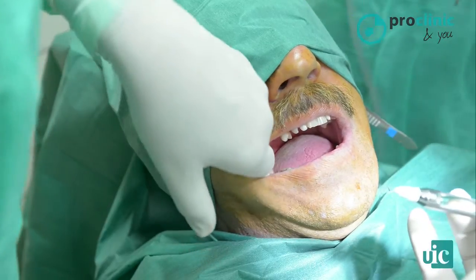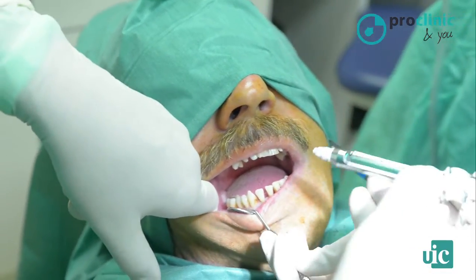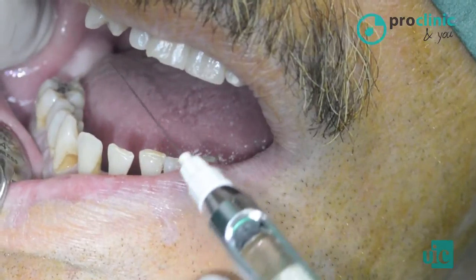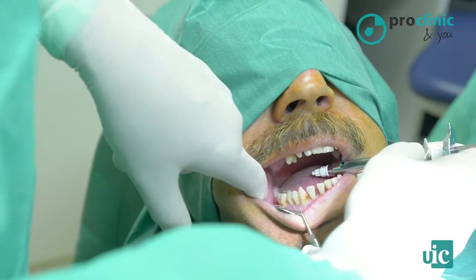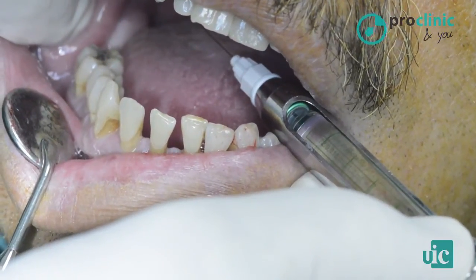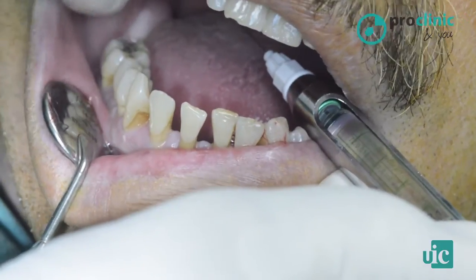To be accurate, we have to check manually where the anterior edge of the ramus is. I'm touching it now. And the Spix's spine is more or less located at the level of the occlusal surface of molars. This would be the point of puncture. Now that we have made the puncture, we can inject the anesthetic. We have to reach the bone, retract a little bit, and before injecting, we have to aspirate in order to avoid a local anesthetic infiltration into a blood vessel.